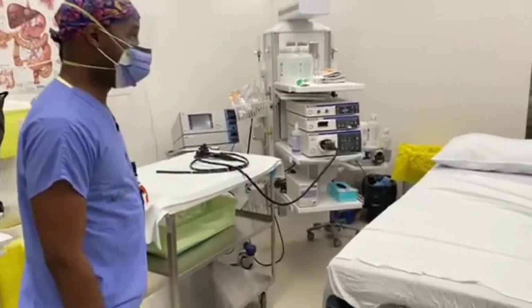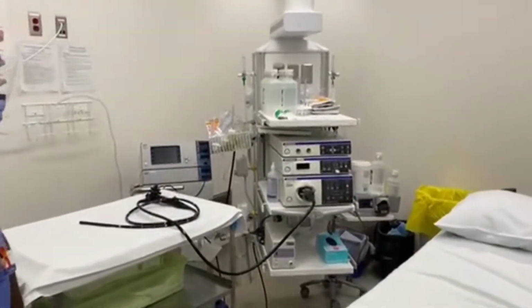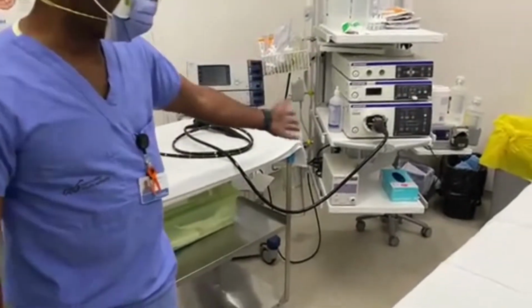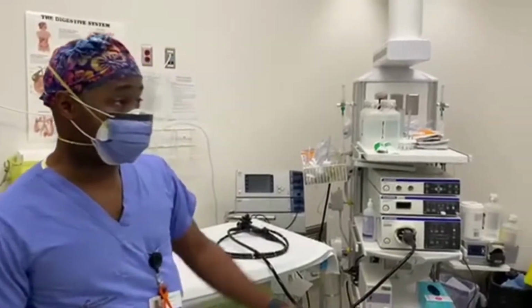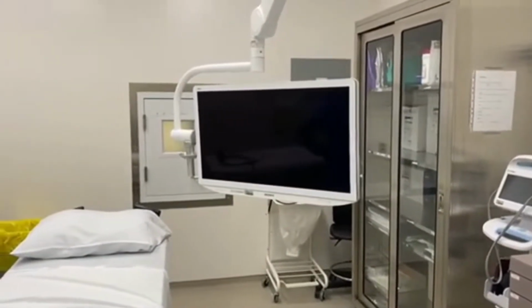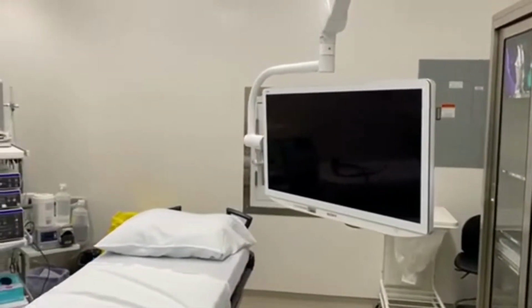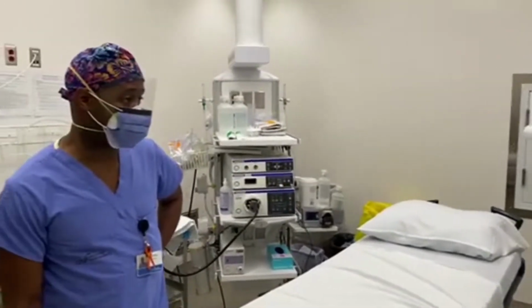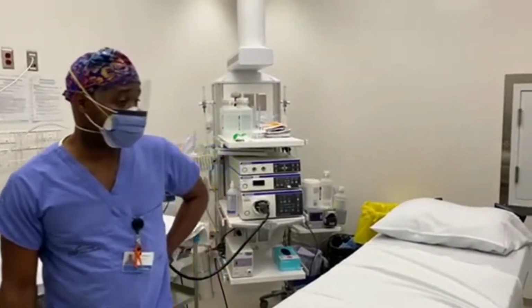Just to show you a bit of what the equipment's about. So we have a high-end, high-tech endoscopy tower here attached to one of our endoscopes. There's usually a lot more tubing set up, but after hours we've taken most of that down. And this is all hooked up to one of our magnificent screens here. So high-definition screen allows us to see in great detail what's going on at the level of the mucosa. So, for instance, we're able to see polyps that we weren't otherwise able to see and remove them and prevent those polyps from growing into other important lesions.